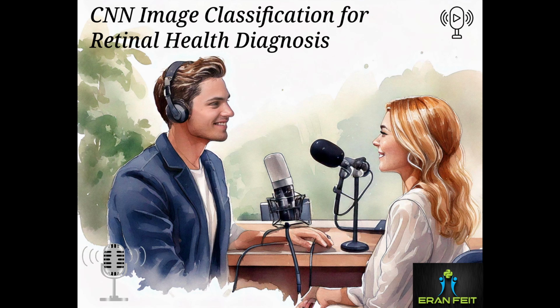Yeah, that's a good way to think about it. And validation steps are similar, but they refer to the batches of images we use to check how well the model is doing on images it hasn't seen before. Oh, so like a pop quiz to make sure it's actually learning, not just memorizing. Right, exactly. Now, what about this early stopping thing?